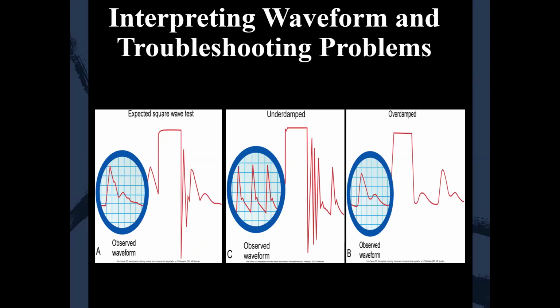Really take a look. And I probably would say I see overdamped more often than underdamped. And it's usually due to the position of the patient. They have their arm bent, or the line's just not in the correct place.